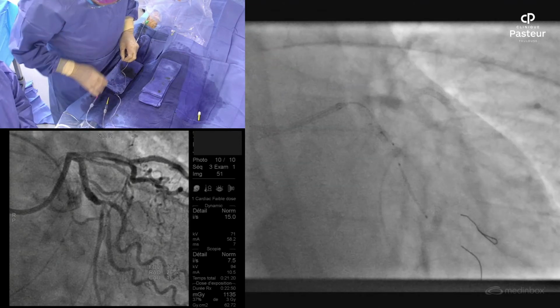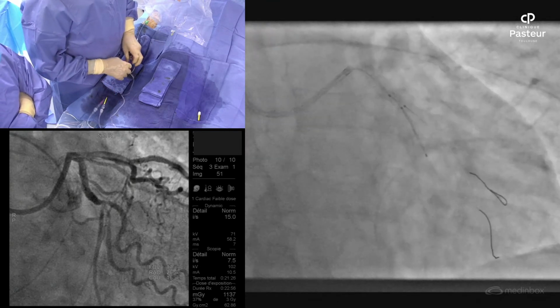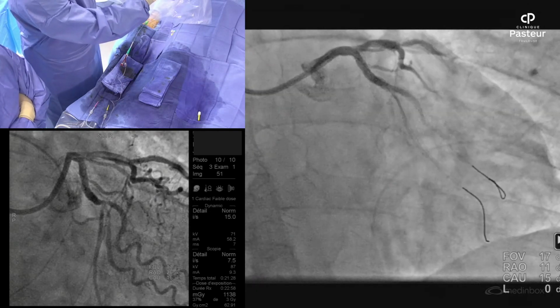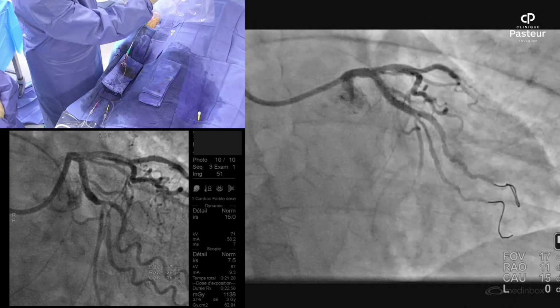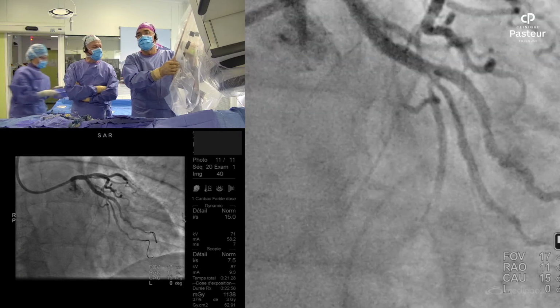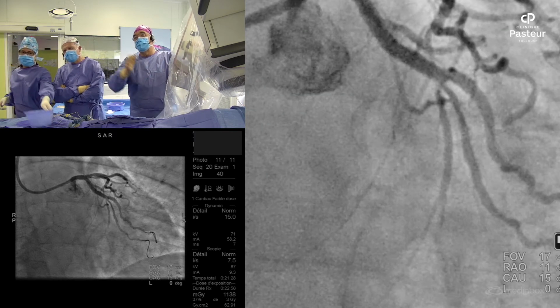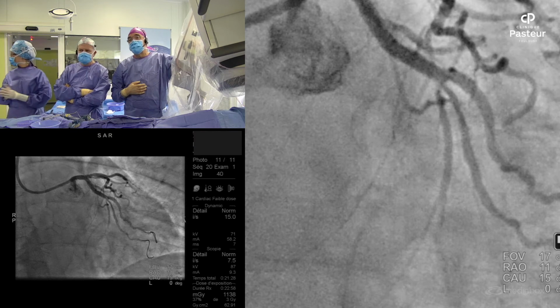So there was a question about the decision to put a second stent because there was no evidence of flow limiting TIMI flow reduction. And the question was, can we leave this result after balloon? That's a possibility, effectively. But probably it's a long lesion. You see, the problem is there was no evidence of dissection, for sure. There was no flow limitation. But this is the result, you see. And the ostium, and it's a particularly long lesion. It's more than 12 millimeters, close to 15 millimeters.